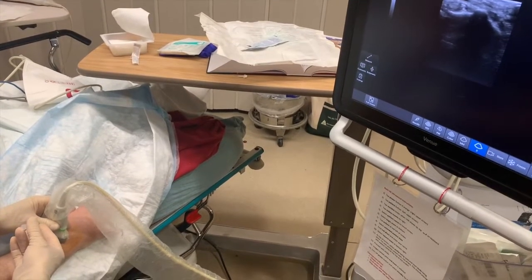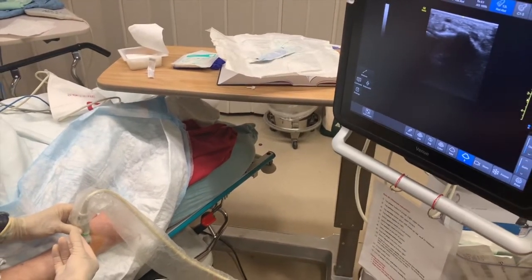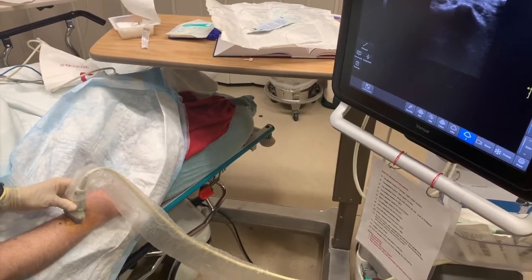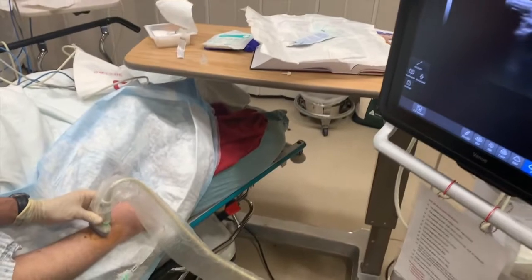I can kind of use that small needle to guide too. I've got a relatively small needle — I think this one's a 21. What are we getting out of here?